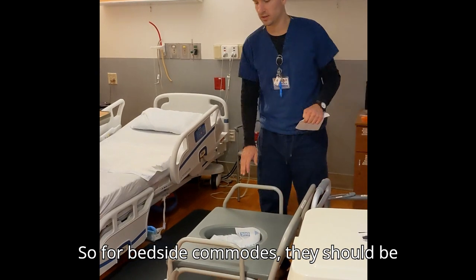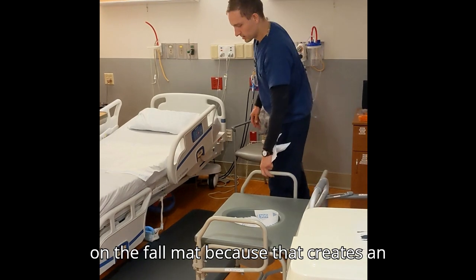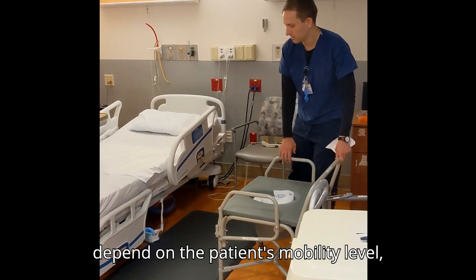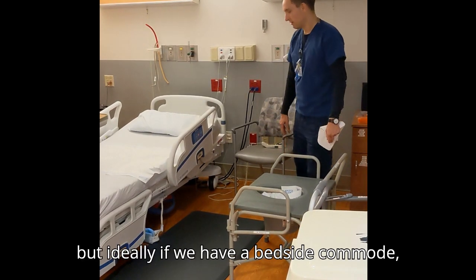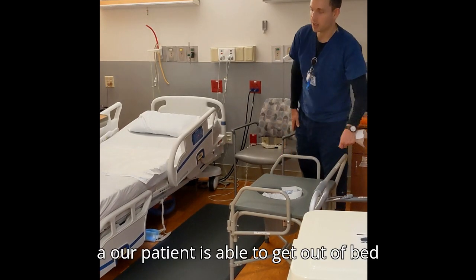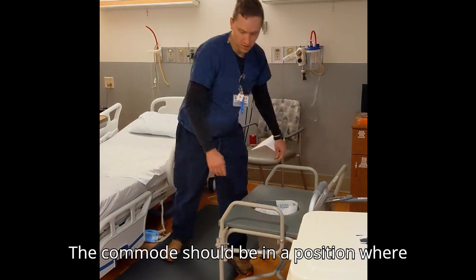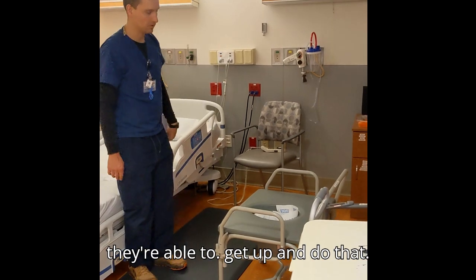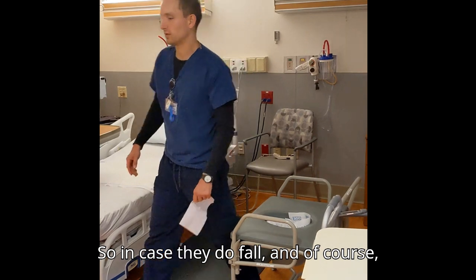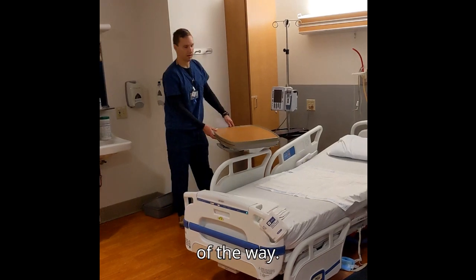So for bedside commodes, they should be on the ground. They should not be on the fall mat because that creates an uneven surface. It's obviously going to depend on your patient's mobility level, but ideally, if we have a bedside commode and our patient is able to get out of bed and rotate 180 degrees, the commode should be in a position where they're able to get up and do that. In case they do fall, and of course before we're getting them up, we are moving any things they could hit their head on out of the way.